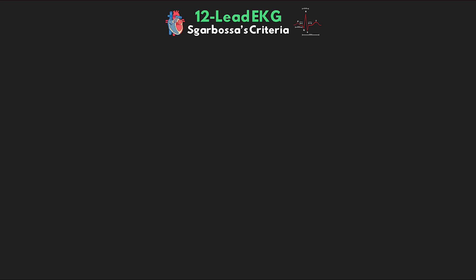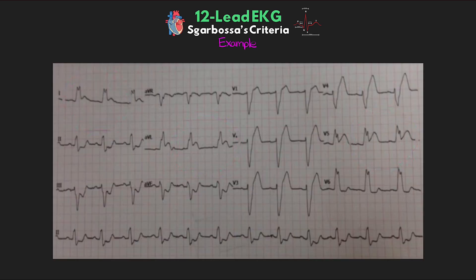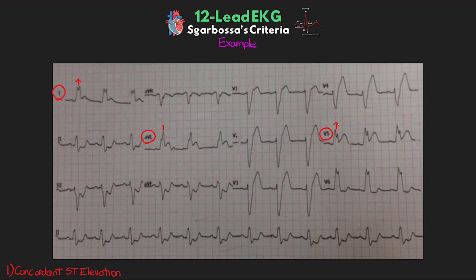Now that we've covered the criteria, let's look at an example of an EKG that shows all three of these criteria present. Starting with concordant ST elevation — hopefully you can see it in three different leads. If you look at our lateral and high lateral leads, you can see concordant ST elevation in leads I, AVL, and V5, all at least 1 mm in height. With these predominantly positive R-waves, due to the rule of appropriate T-wave discordance, we'd expect to see negative T-waves and ST depression, but instead here we have ST elevation. Seeing this in even just one lead, we can say this patient is having a STEMI.